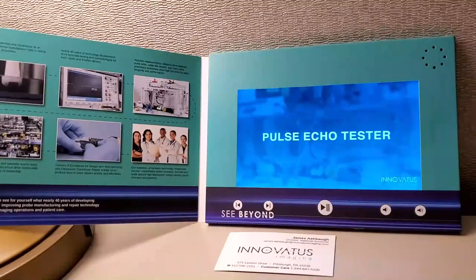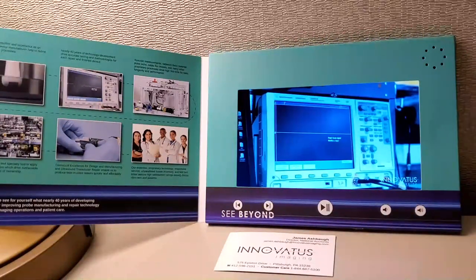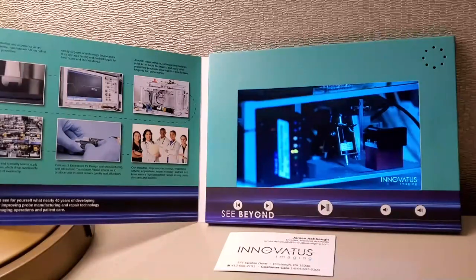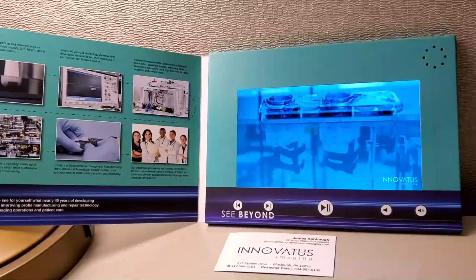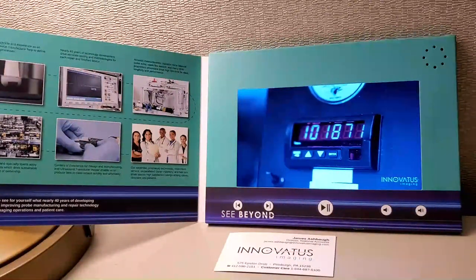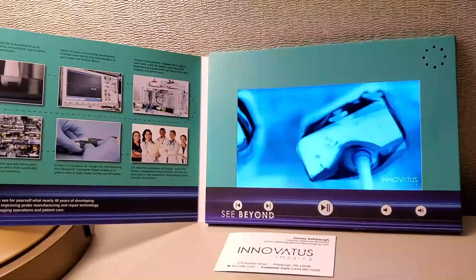A pulse echo tester is a critical piece of equipment for any array manufacturer. This allows us to apply a transmit pulse and record received characteristics on every element of every array we manufacture, ensuring a consistent product that performs as expected. A cable flex tester — also known as a tick-tock test — characterizes the longevity and life of a cable. Anytime we repair a cable or bend relief, we qualify it on this device to ensure the product is robust and the repair is sustainable.